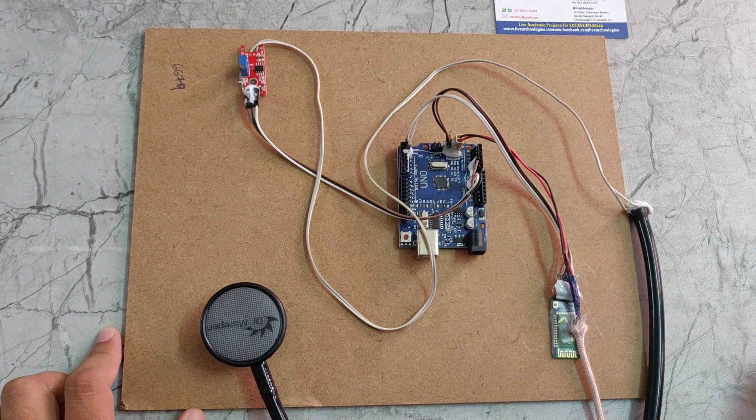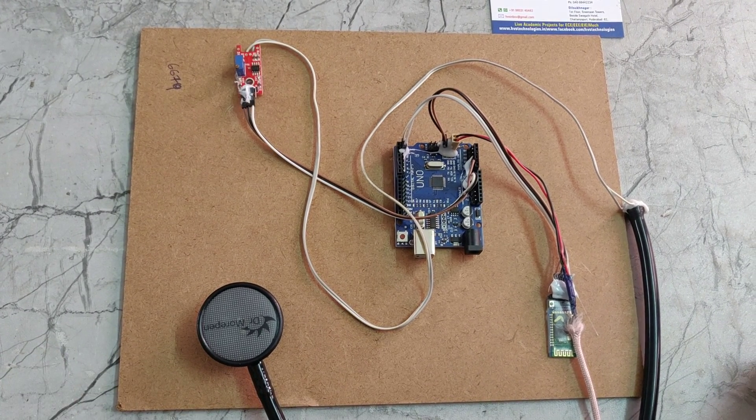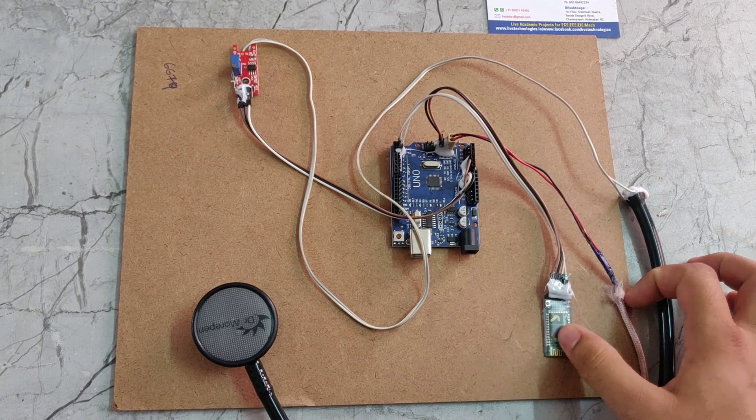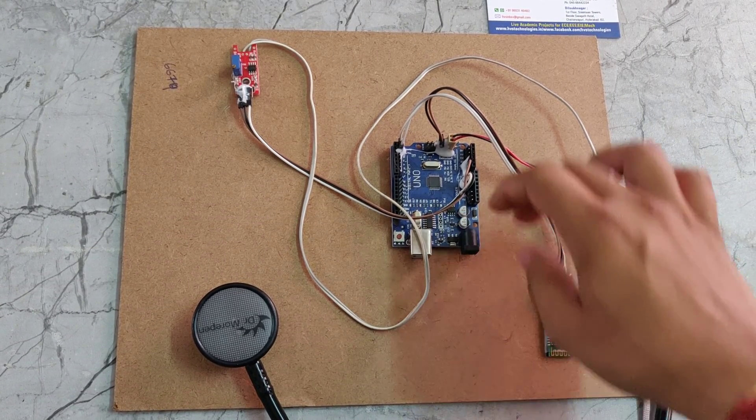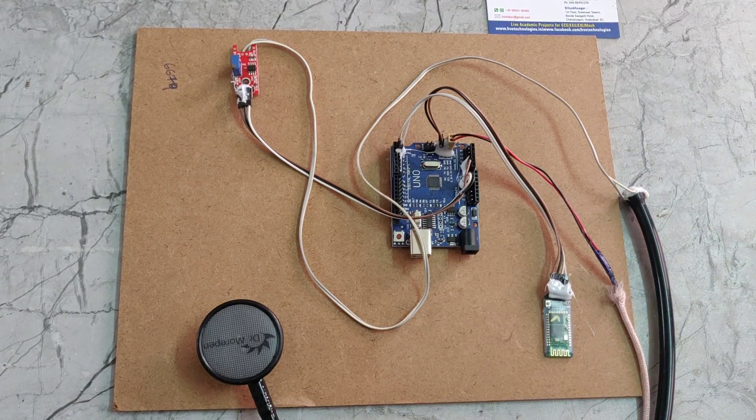Welcome to the project demonstration of wireless digital stethoscope. In this project we are using HC-05, Arduino Uno, sound sensor, and a stethoscope.